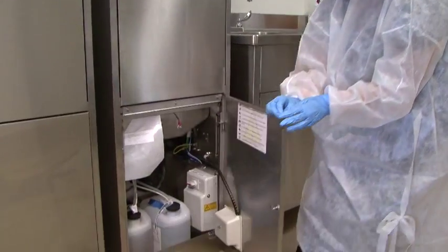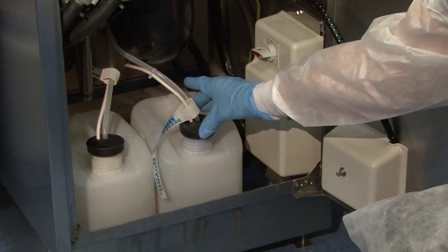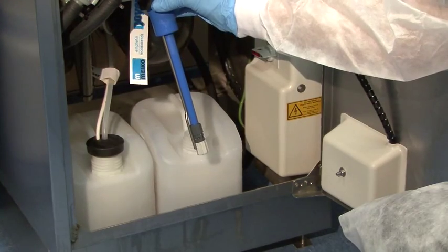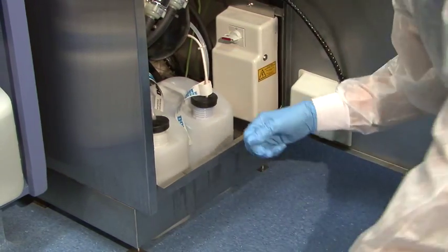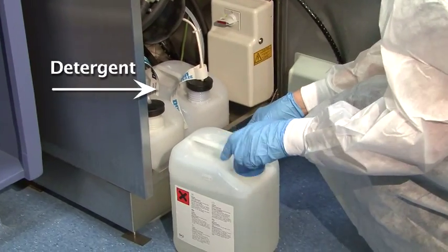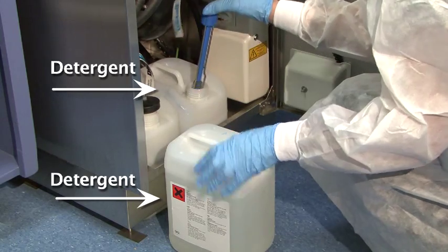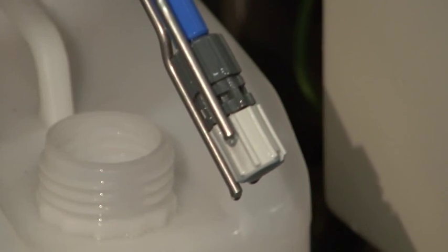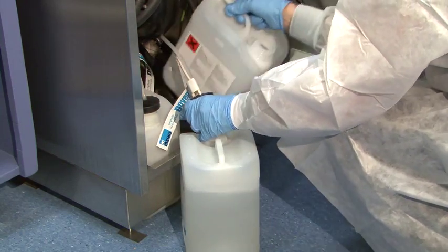The Myco washer will visually warn you when you have 25 cycles remaining for either detergent or the softener rinse agent. This detergent or softener rinse agent should be replaced at this time. To replace it, open a new jug, take the spigot from the old jug and place it in the new jug. Sensors on the spigot will tell the machine that the new jug is full and the Myco will reset and be ready for use again.